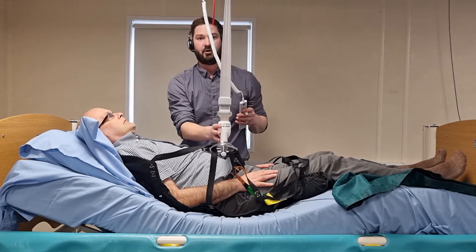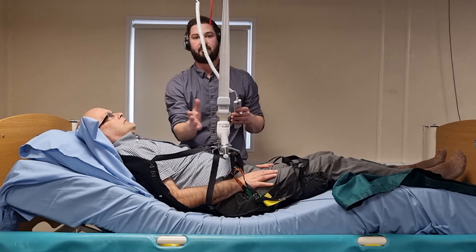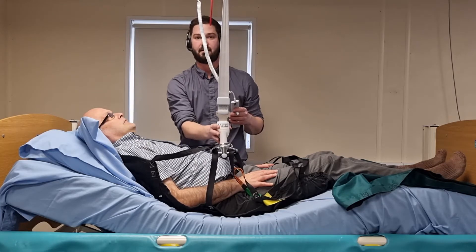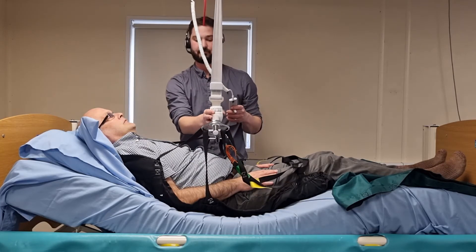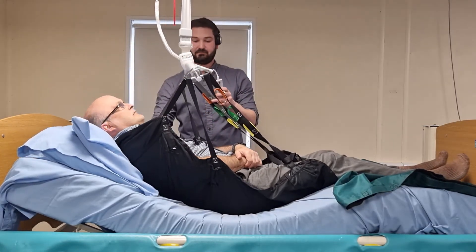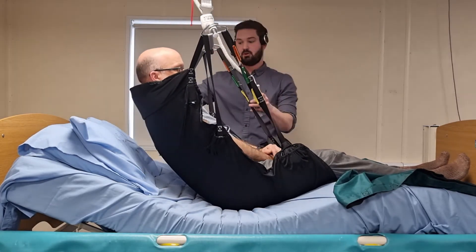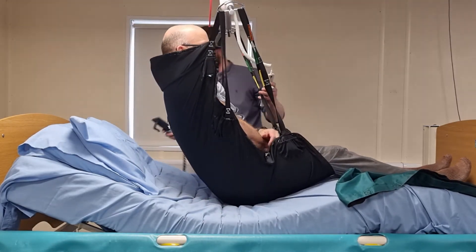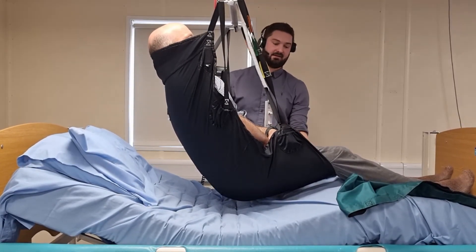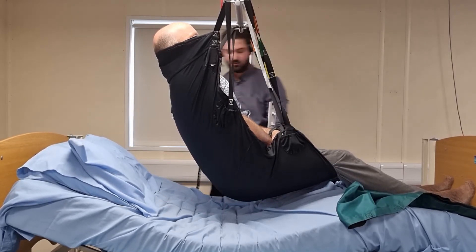Another thing to be mindful of when hoisting is to ensure the carry bar is not too close to the head — I generally put a hand between the person and the carry bar just to create that barrier and ensure their safety. I'm going to bring them up off the bed and also lower the bed to demonstrate the fit of the sling. There we go — we've got clearance.